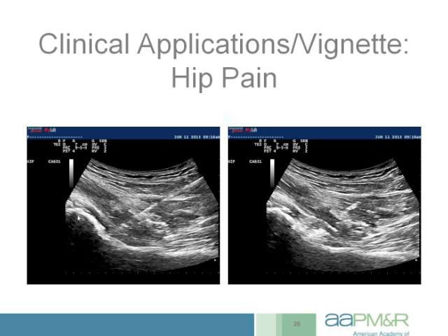This picture here on the left demonstrates the head of the femur, neck of the femur along here. And in these views here, the probe is essentially in a parasagittal orientation. So if you imagine sagittal over the hip joint and then aligning from that point with the neck of the femur, that's the view we're looking at. One thing that's very nice when you're doing these under ultrasound versus fluoroscopy is you're able to see the extent of the hip capsule. And you can see it come down here about halfway down the neck of the femur.